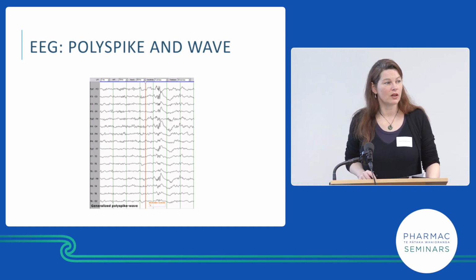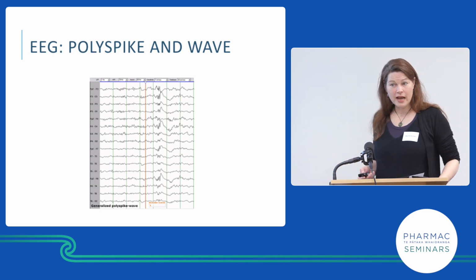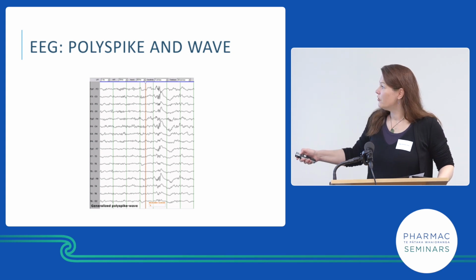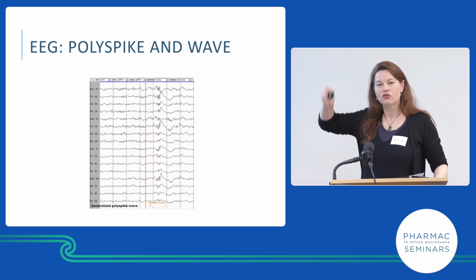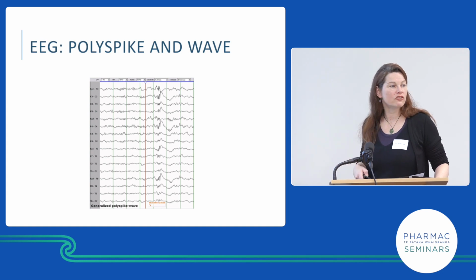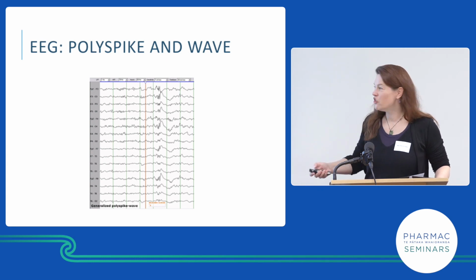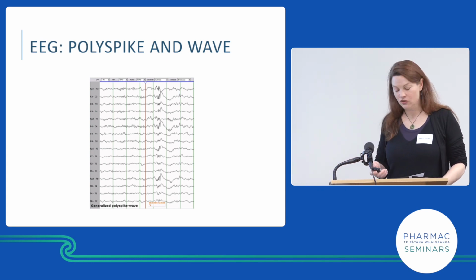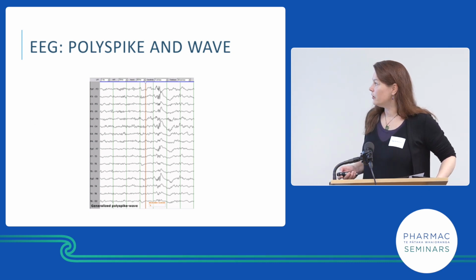That's the diagnosis, okay? I don't have other pictures, but if you have childhood absence, it's the 3 hertz spike and wave. It looks quite similar to this, but it has only one spike. So one spike and wave, and then there's 3 of them in the space of 1 second. That's why it's 3 hertz. It's a very synchronous, very elegant discharge, not as messy as that, and very easy to diagnose. So EEG is an absolutely invaluable tool in epilepsy.